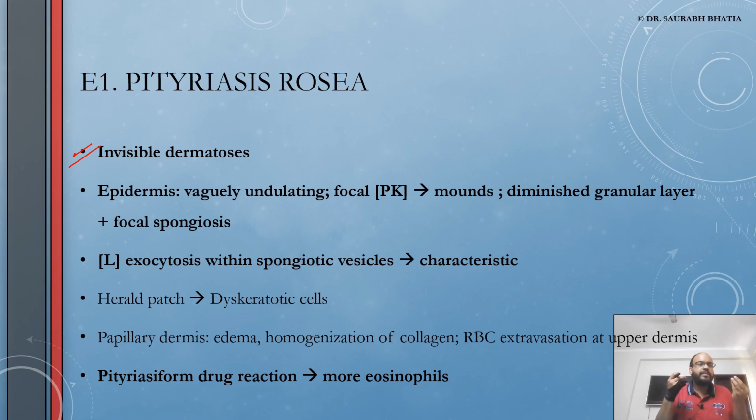The fifth type that we'll discuss now is pityriasiform spongiosis. In this spongiosis, you have microvesicles, but they have other inflammatory cells also. You have lymphocytes, you have histiocytes, you have Langerhans cells. And a lot of these disorders show scaling. Pityriasis means scales. Pityriasiform spongiosis. So you have a lot of scaling.